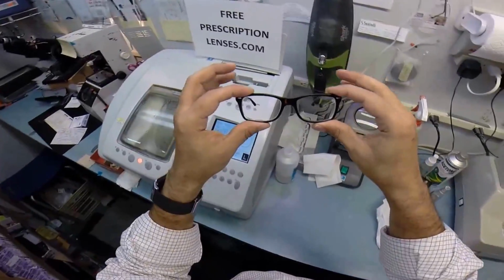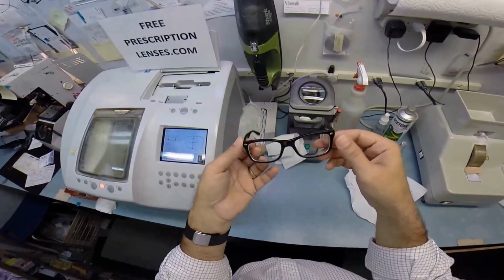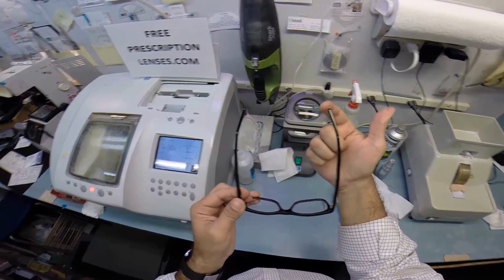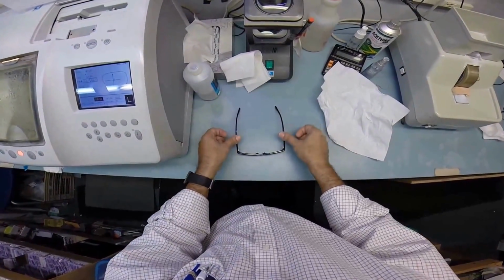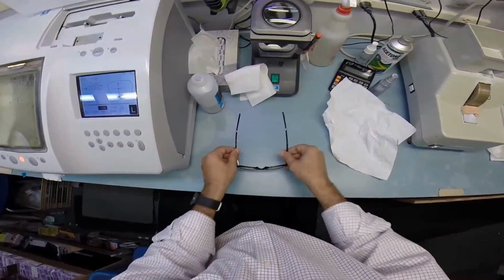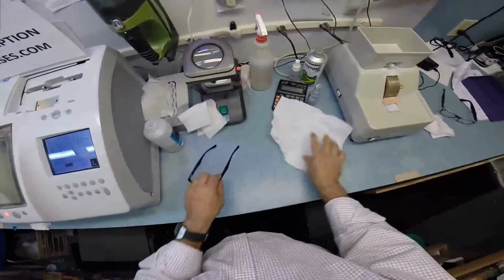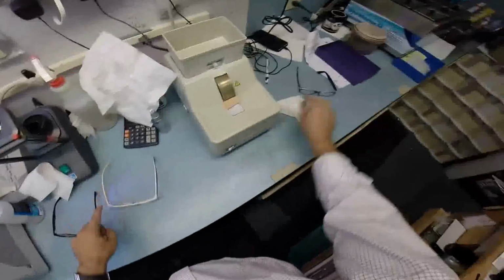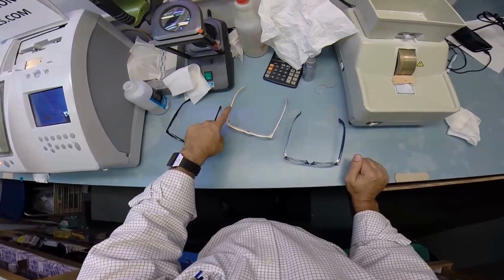You may be perfect, I'm sure your husband thinks so, and you may not need these adjusted, but I'm going to go ahead and get them in standard alignment, also known as a 3-point stance. The 3 points are 1, 2, and the bottom of the frame being 3. I set it on the counter and press down, there is no wobble. I flip it over, press down, there is no wobble. When I say wobble, I'm part of that 80%. I have one ear that's higher than the other, so when you press down on mine, there's always going to be a wobble, but they sit level on me.